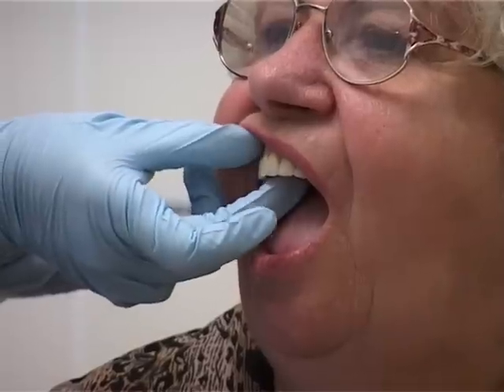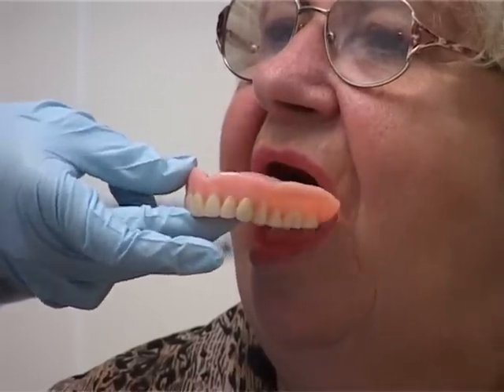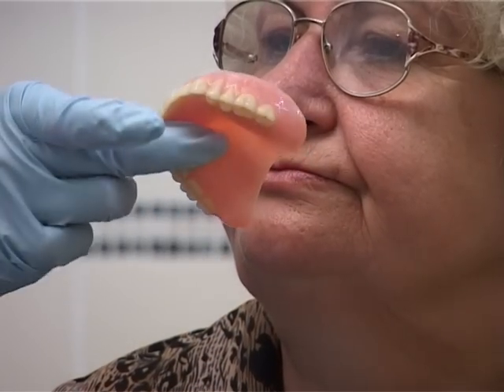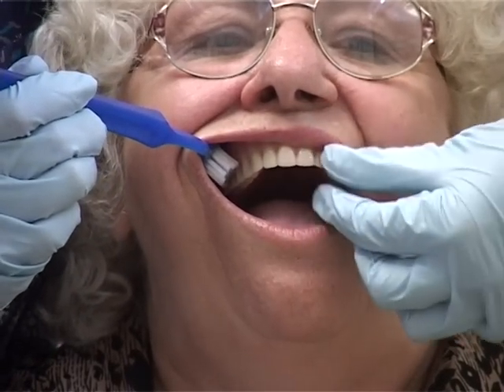If that doesn't work, you may have to break the seal by pulling down on the denture along the side of the denture. If a person has challenging behaviours, try using a backward bent toothbrush to help to break the seal.